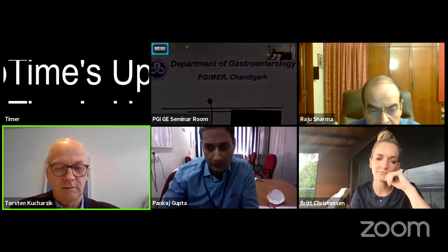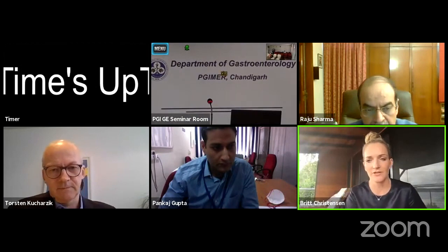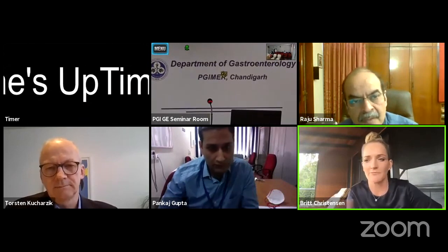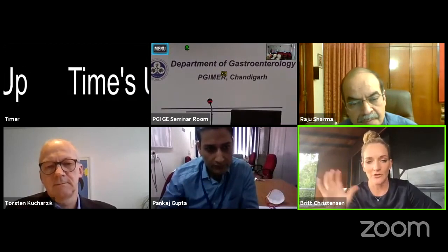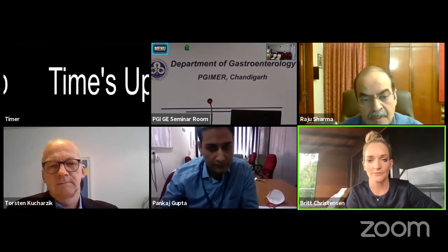What do you think, Britt? I totally agree. I think it's very rare. It's more if you're worried about a stricture and you're wanting to get a better delineation of what's going on. That's the only time I would consider it. You just saw Torsten's images. The images you get with ultrasound are beautiful. And I think most of the time, especially if you know where the disease is, it's an excellent tool to use on its own.